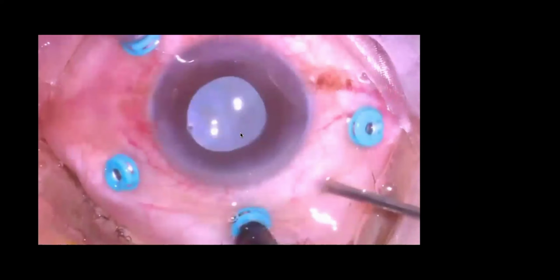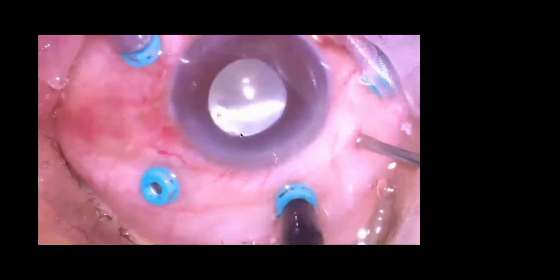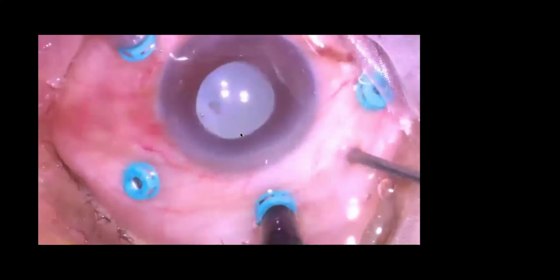And here also remember that you have to lift it up above the retina and the macula and keep the phaco in and use minimum phacoemulsification power, ultrasound power, to prevent ultrasound damage to the fovea. This is the last bit, which is getting cut with the fragmatome. If you don't have a fragmatome, you can use a phaco probe, remove the sleeve and use the phaco probe to do the same job.